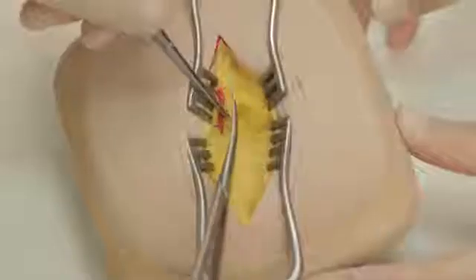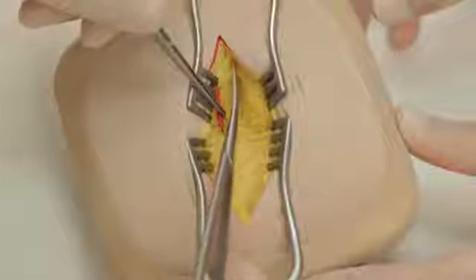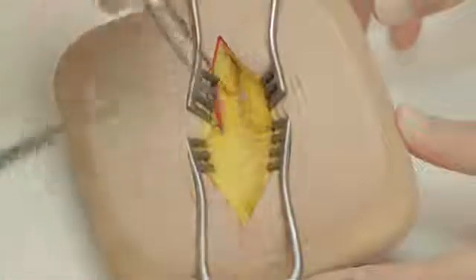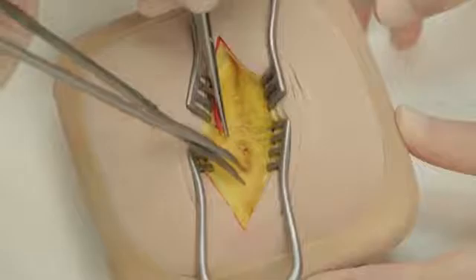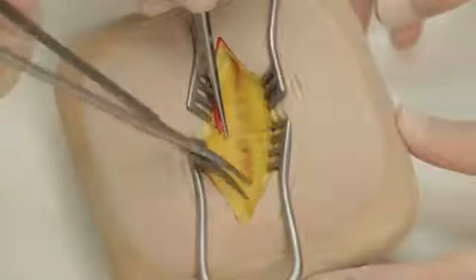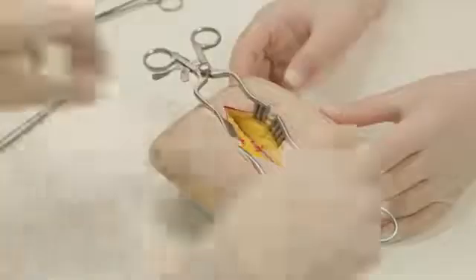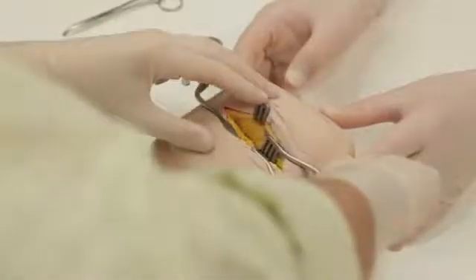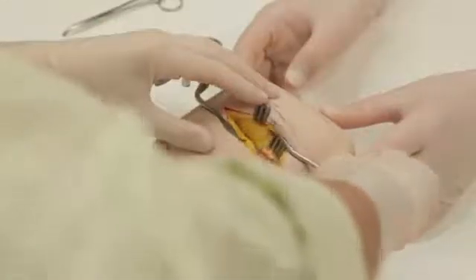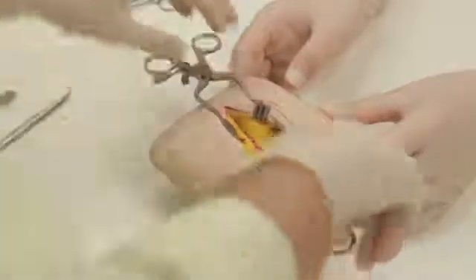Deepen the incision by dividing any connective tissue to expose the fibres of internal oblique. Again, reposition the self-retaining retractors so you have an optimum view.